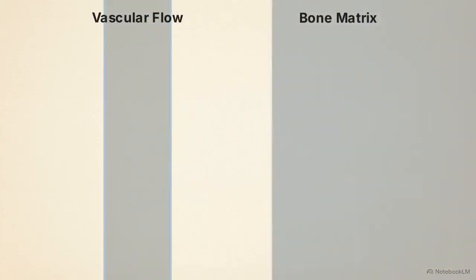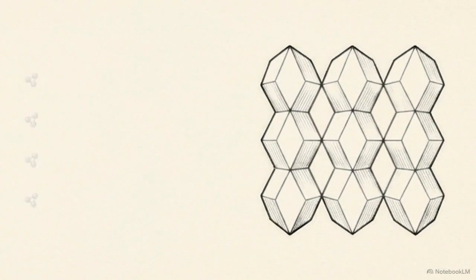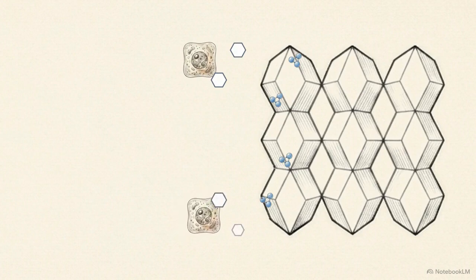These outcomes are determined by the tracer itself. Technetium-99m methylene diphosphonate does not map the disease, it maps osteoblastic activity and localized blood flow. Through chemisorption, the MDP molecule binds directly to the crystalline hydroxyapatite in the bone. This binding occurs strictly at the mineralization front, immediately adjacent to the bone-building osteoblasts.